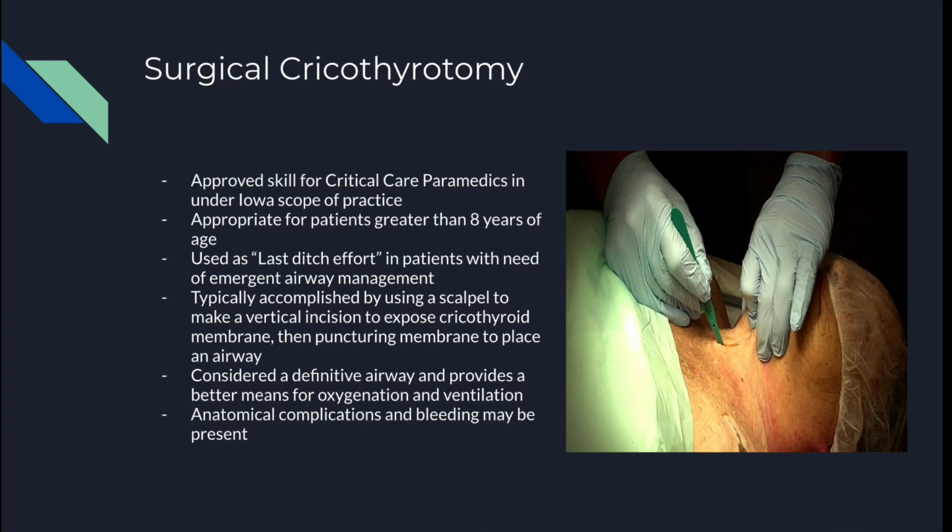So this is actually considered to be a definitive airway. So once you get an airway in here, they're going to use this as the patient's airway probably throughout, when they get to the ER, their ICU stay, whatever the situation may be. They can attach a ventilator to this. This is going to be their airway. So this is an excellent option when all other options have been exhausted.